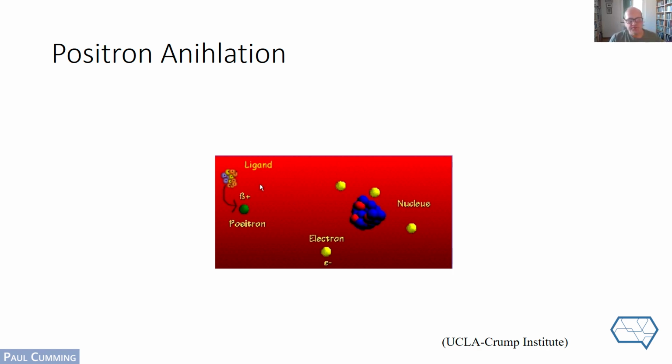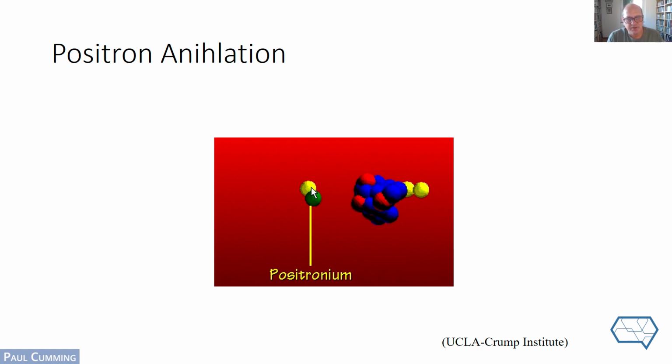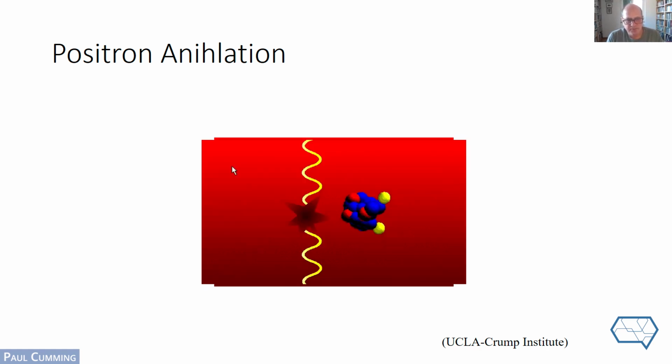Next, forward. And it then encounters the electron in the medium of the brain, positive and negative charges being the only difference between the positron and the electron, but they are attracted to each other electrostatically. Next slide. And they merge together in this fatal attraction as a short-lived element, let's say, called positronium. Next slide. Which almost immediately annihilates, releasing all the energy bound up in that electron-positron pair as two photons. You can see one leaving from the top and one leaving from the bottom as waves.